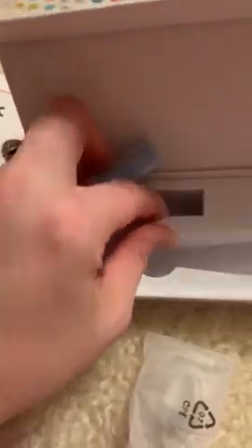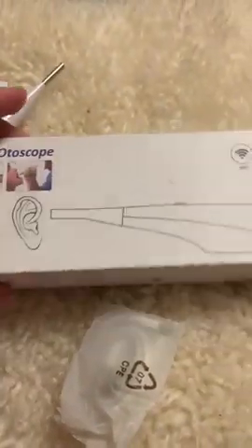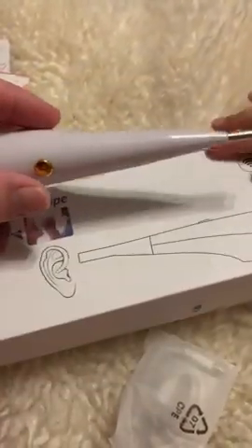I love that the box is kind of sturdy so my kids can't ruin it. I just keep it in our medical cabinet. That's pretty much it — it's simple to use. You just download the app and open it when you want to use it, and you're good to go.